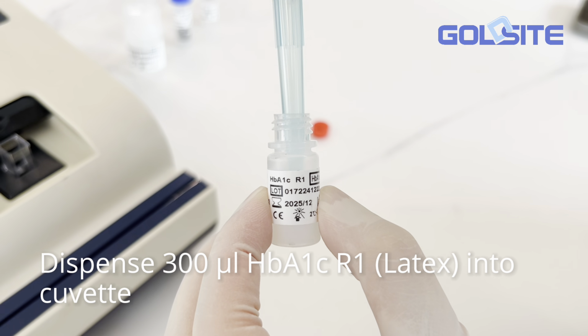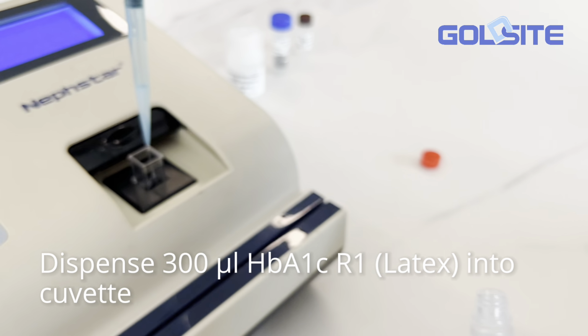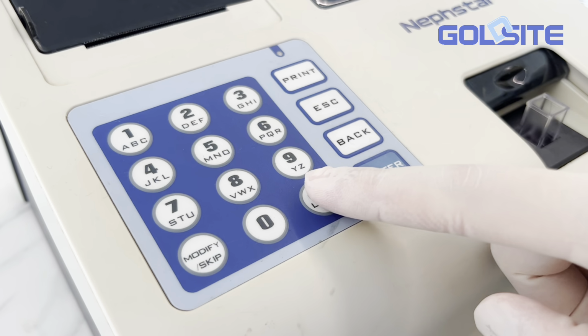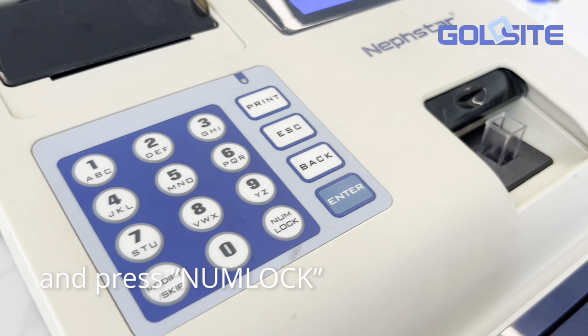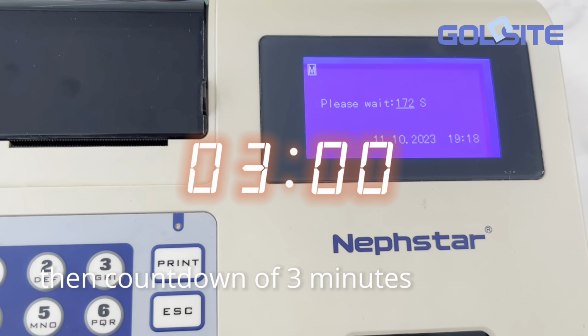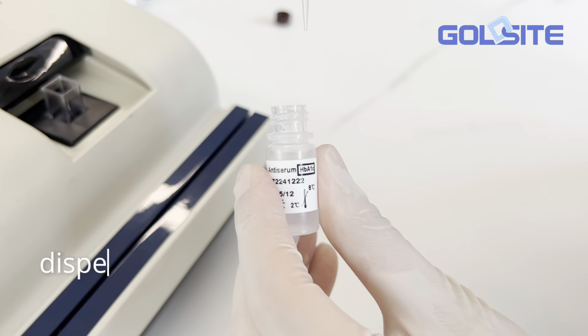Dispense 300 microliter HbA1c reagent 1 into the cuvette, and press number lock. Then count down of 3 minutes.